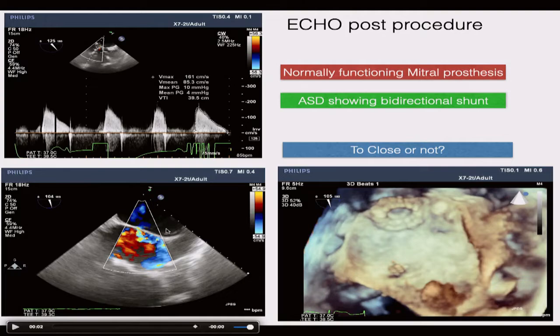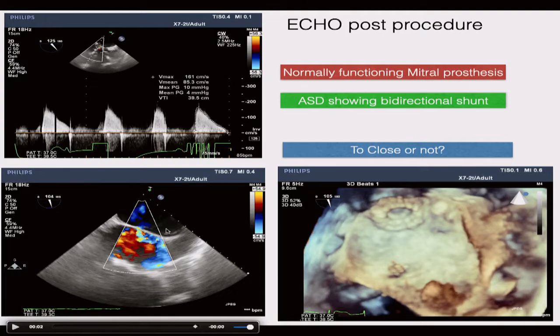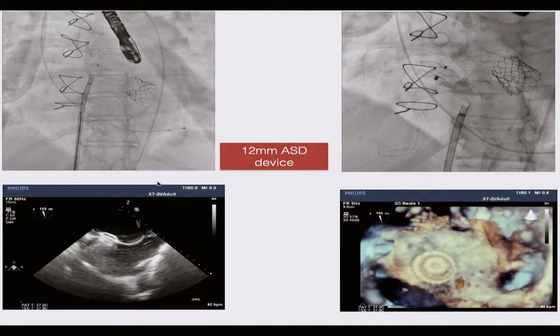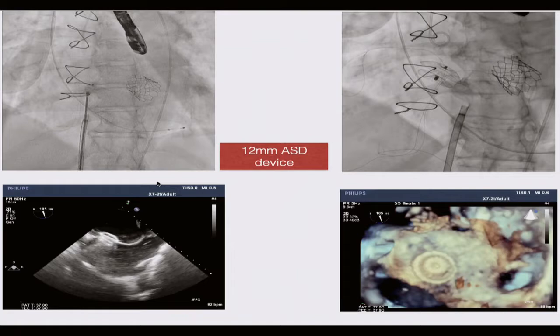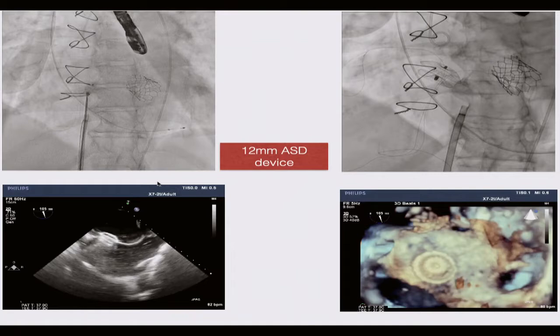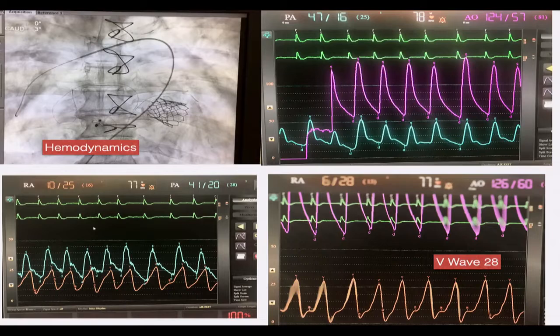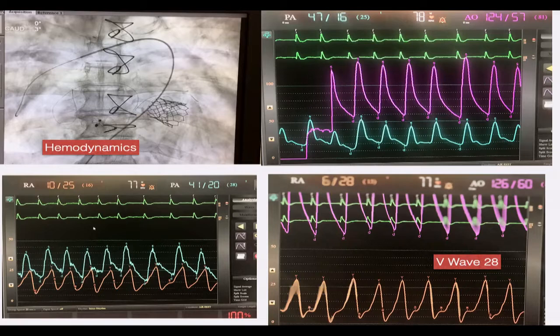This patient had RA and RV enlargement with severe tricuspid regurgitation but normal RV function. We ended up doing an ASD closure using a 12mm ASD device. To assess the ASD: check O2 saturation, assess the shunt direction — right-to-left, left-to-right, or bidirectional. In patients with severe tricuspid regurgitation, the jet can go toward the septum, and we closed it with an ASD device.